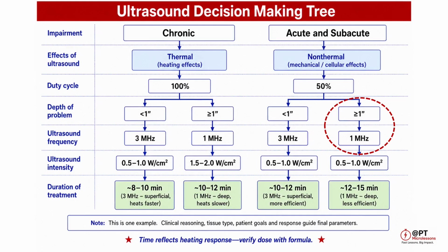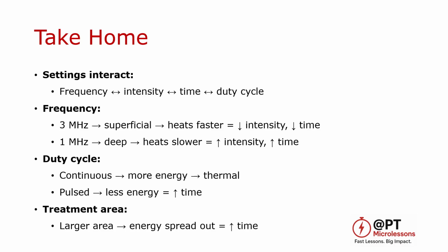This means that overall energy delivery is reduced from two directions, both depth and duty cycle. As a result, treatment time is often increased to achieve the desired non-thermal effects. This again highlights that when energy delivery is reduced, whether due to depth, intensity, or duty cycle, treatment time must be adjusted to compensate. To wrap up, the most important concept is that ultrasound settings do not work in isolation. They interact with one another.